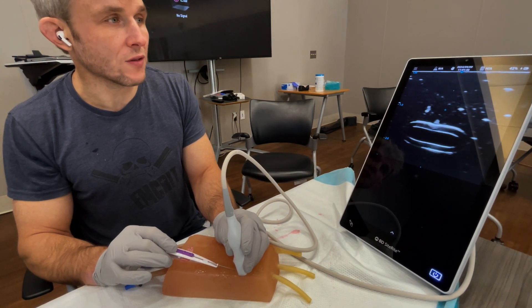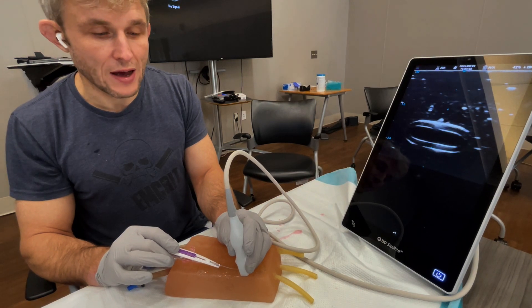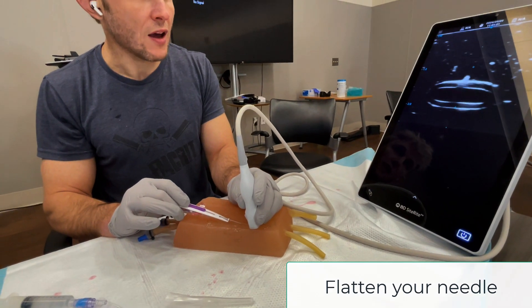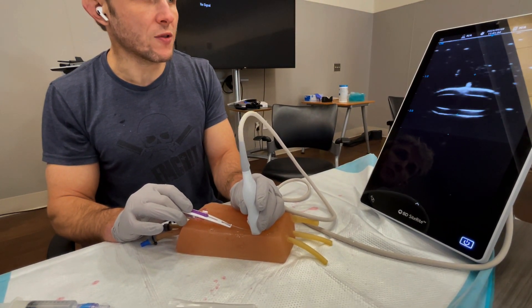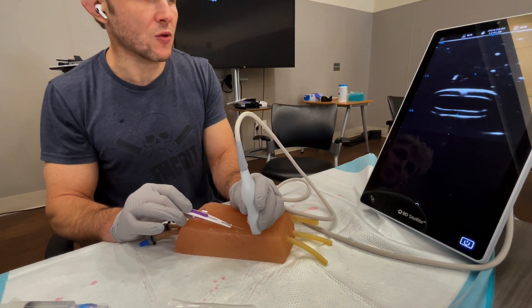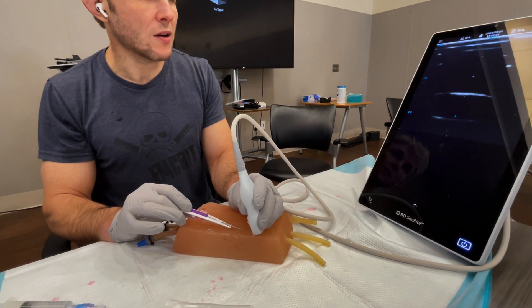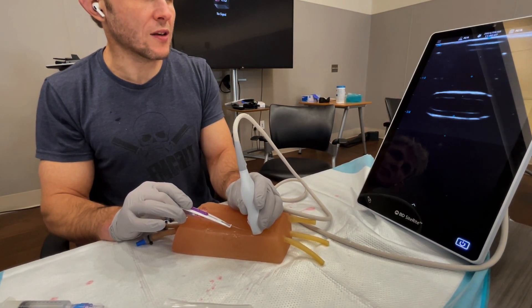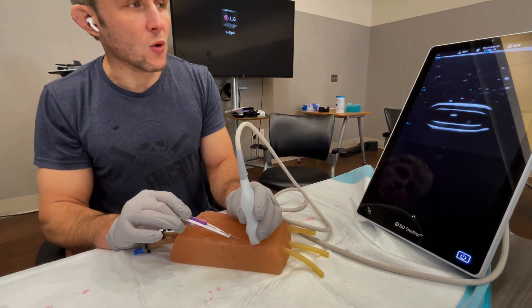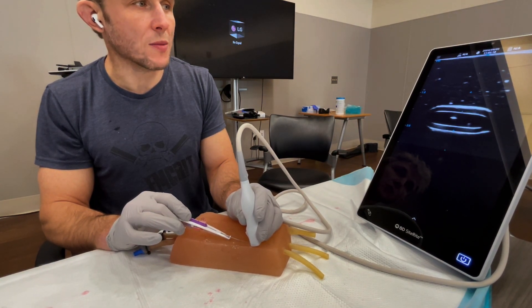I've made it all the way down to the vessel wall now. At the vessel wall, I flatten my needle as far as I can — this is where the overhand grip is very useful. I press my probe until I can no longer see the tip, then move my tip a little bit and I can see it again. I move the ultrasound probe so it's gone, then needle again. I keep doing this until I get into the vessel. Now you can see my needle tip is in the center of the vessel. Before I thread my wire, I want to walk the needle farther up the vessel to make sure I'm well centered.